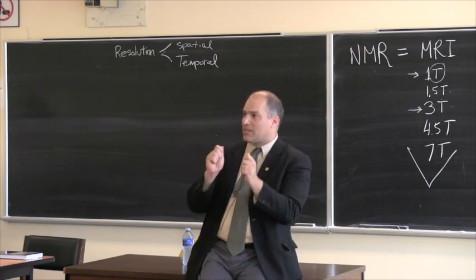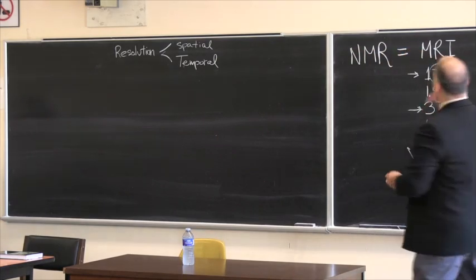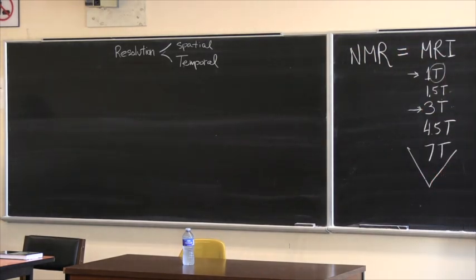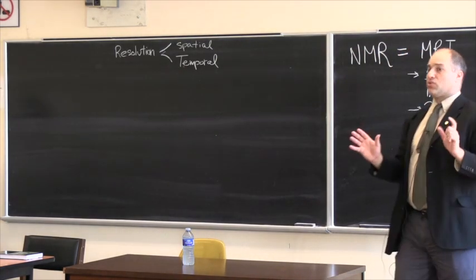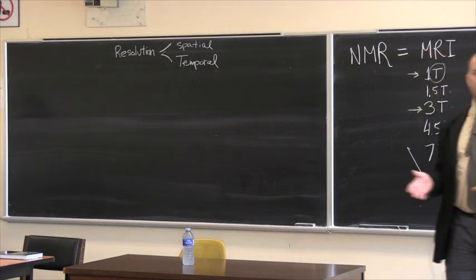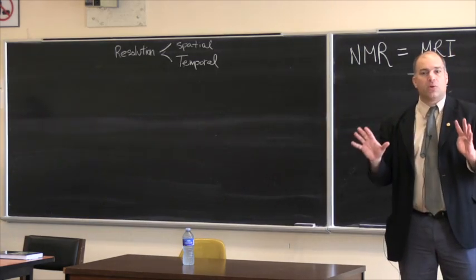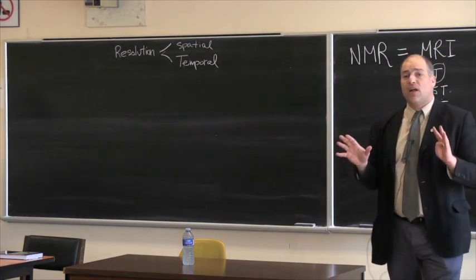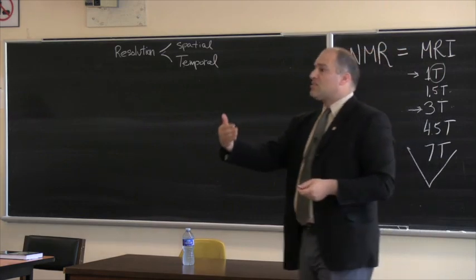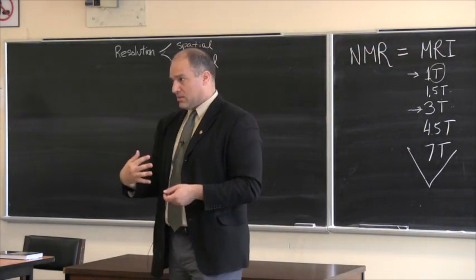It's very important to understand what MRI does, in a very broad, brushstrokes kind of explanation for people who are not from the field. Forgive me, Daniel, for humoring you. It's very important that you understand how it works. It works in the following way. If the blood has a lot of oxygen, the magnetic property is quite different than if it has less oxygen.